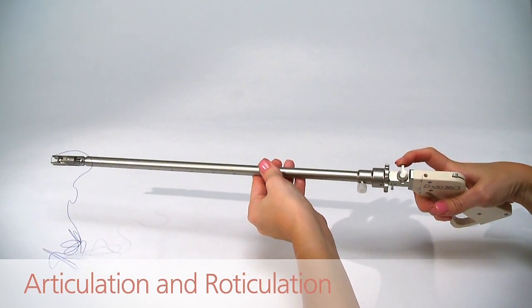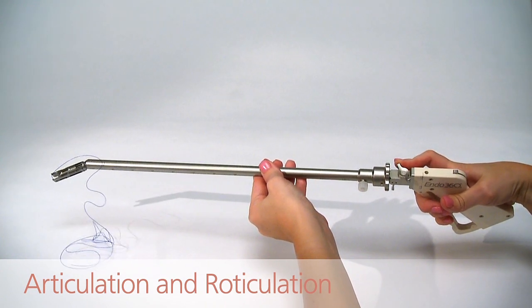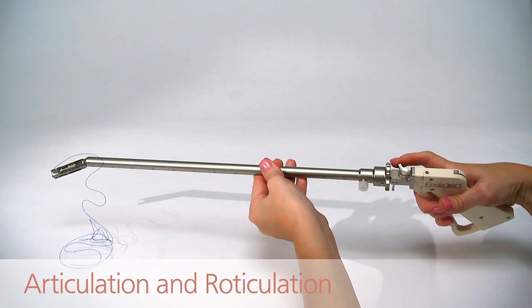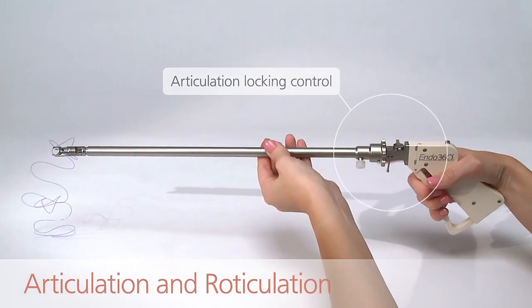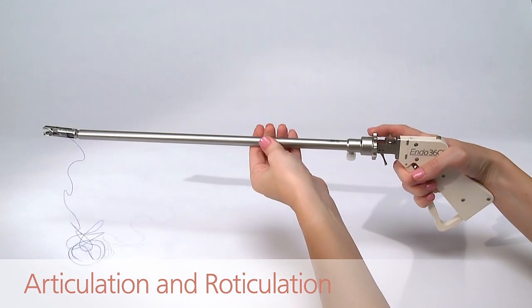The tip of the device can be articulated 60 degrees from side to side. The articulated tip can be locked in place at any angle by using the articulation locking control. The shaft of the device can be reticulated 180 degrees.